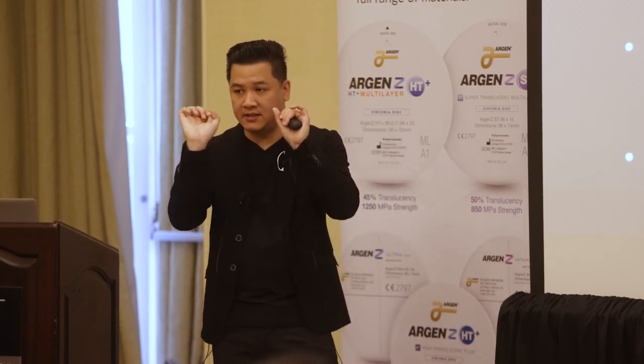So that's really interesting. But why is that interesting to us? Very much like Alice there, the 93-year-old patient, they have very terrible dexterity and the ability to remove these locators or whatnot. And very often you'll go to nursing homes and you'll see the PSWs there using knives or butter knives to kind of crank these things out. And even on the lowest retention, you can't really get these things out.